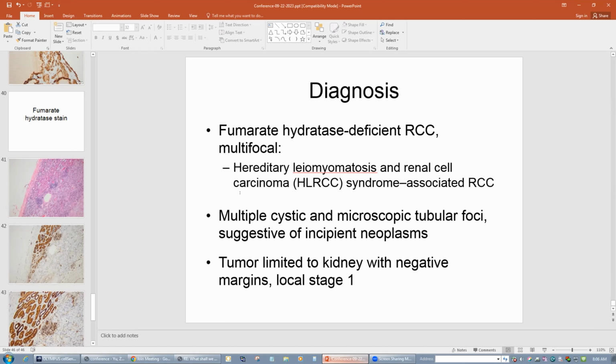But those usually present in middle-aged adult women rather than the pediatric age group in this situation. Are the renal tumors more typical of the pediatric age or more commonly seen in adults? Still more commonly seen in adults.